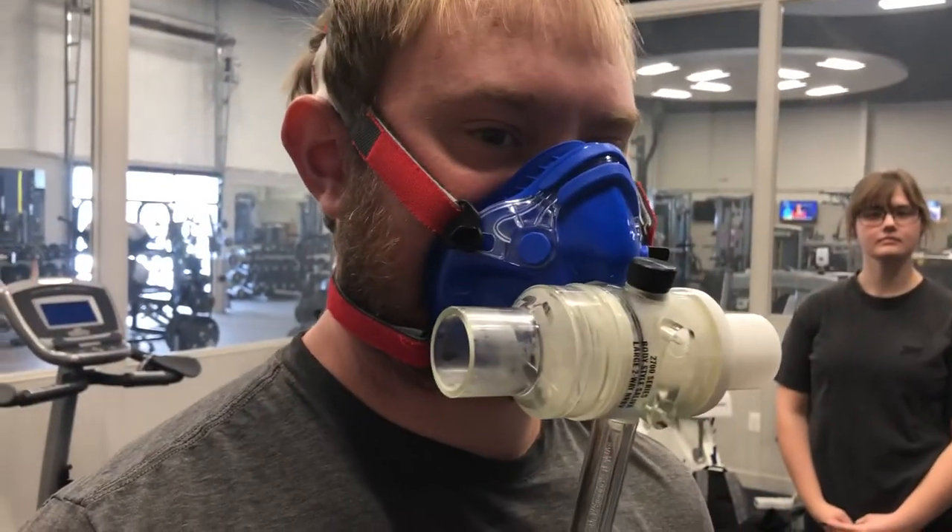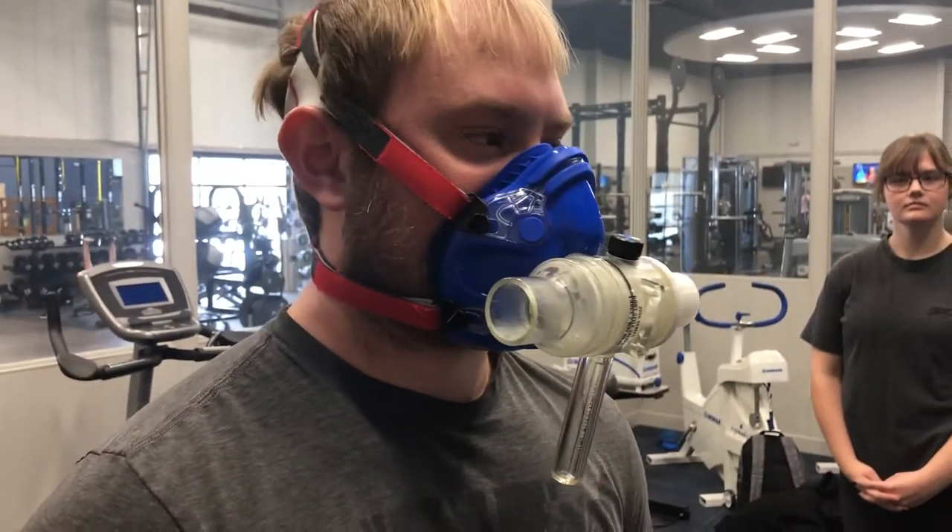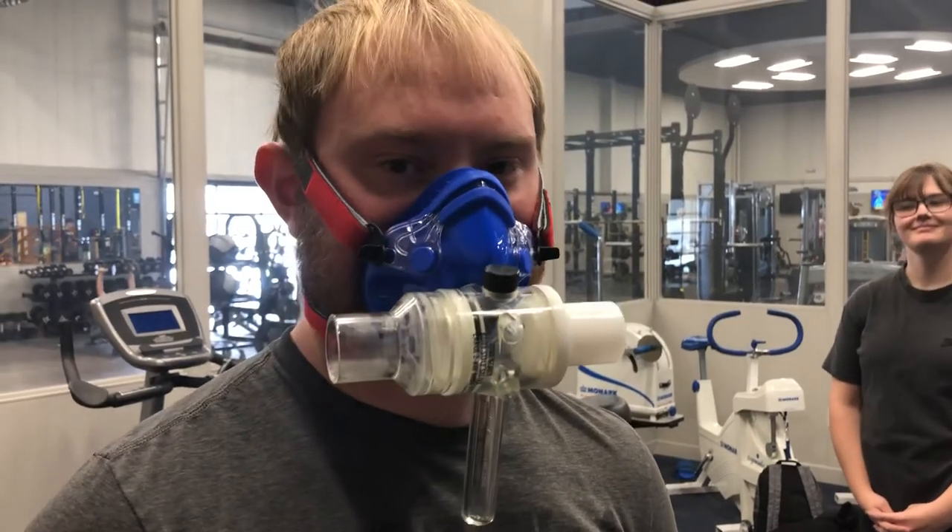We always want to make sure that the clear piece is facing to the tester's right side — that's kind of important. He's all ready to be tested now; we just have to hook the hose up and get started, so that's the next step.